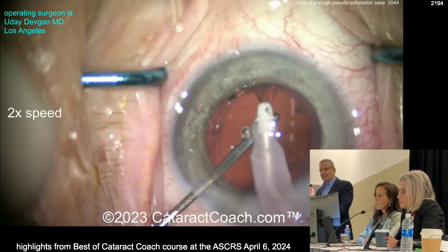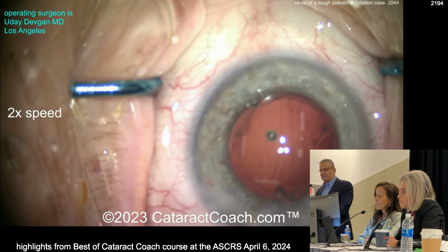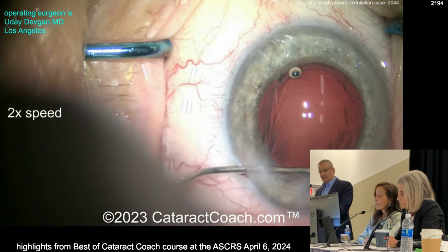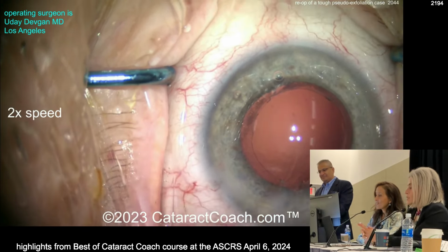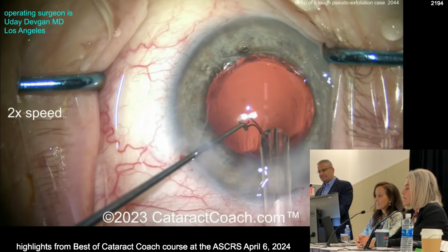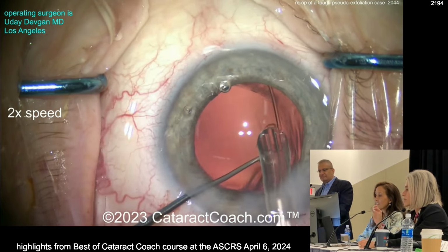I was actually going in here with a little bit more trepidation because the previous surgeon, who I respect a lot, said, no, this is a tough case. And so we're going to put here, now I've learned from you, look, visco dissect the cortex, fill the bag. See, I learned. The other key here, just while we're waiting for you to put the IOL in, is CTR. Sorry, is to also make sure there are no nuclear fragments under these irises.